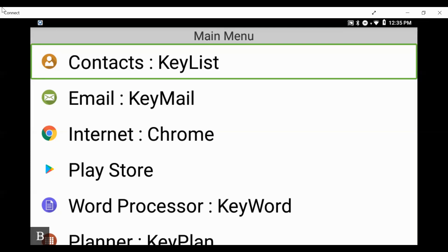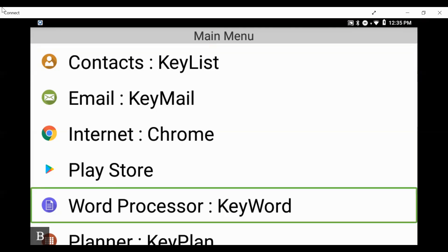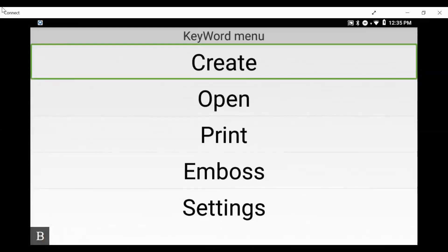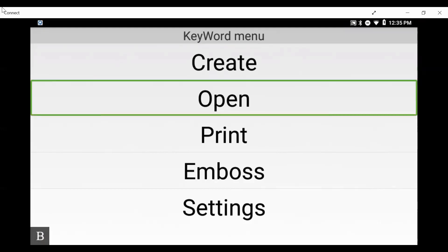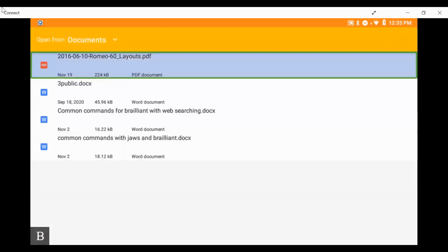We're going to be looking at the document that HumanWare has created on using the Brailliant BIX series with JAWS. I am on the main menu and I am going to press the letter W to open and get to Keyword, then open it up. I press W to move to the word processor — 'word processor' — press enter to open, then in the Keyword menu I want to open my file. I'll press O to move to Open and then press enter.